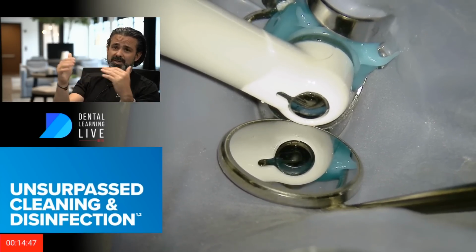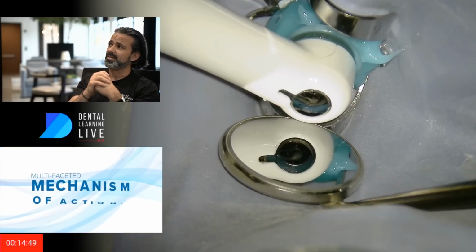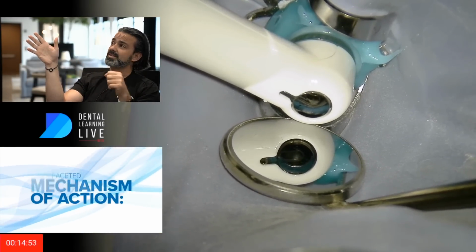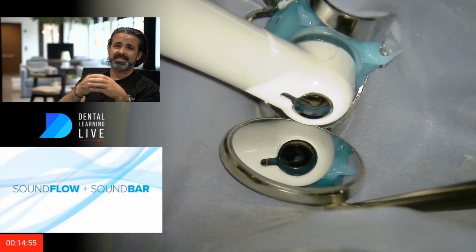And so there's a lot of pluses and minuses between these two things. And one of the things that I've learned in using these just over a ton of cases is that sort of dancing bubble.